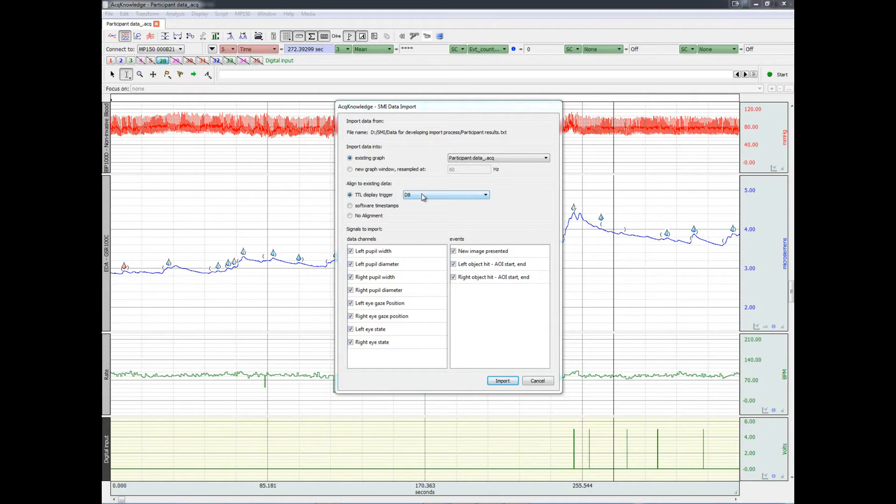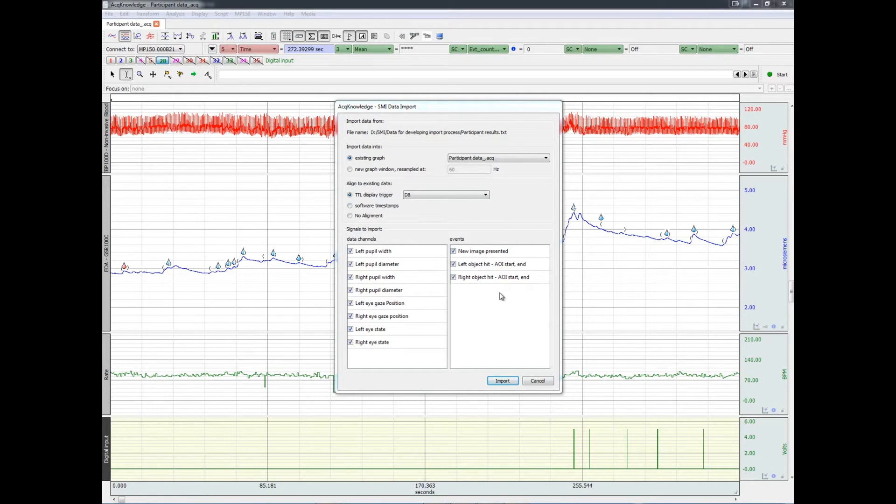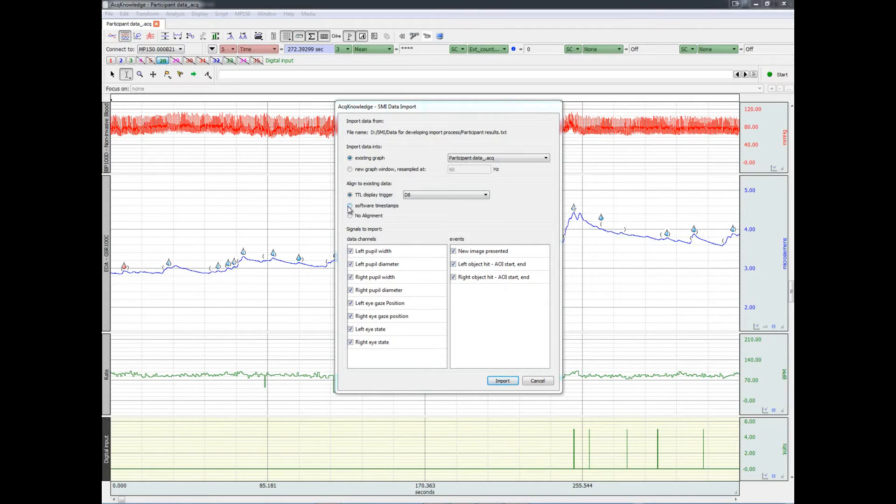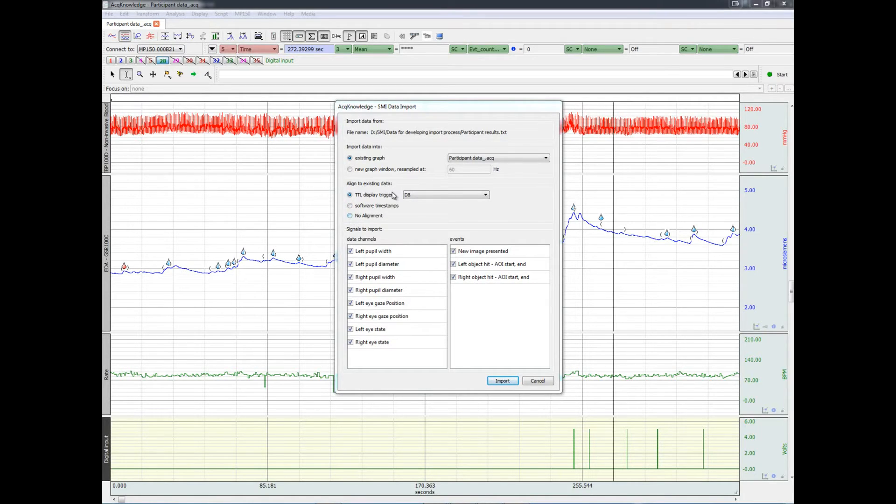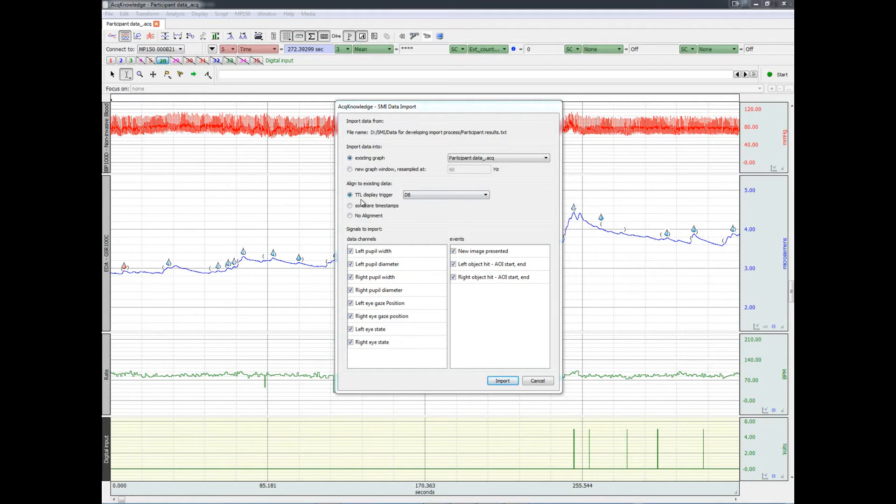We can also choose which signals and event markers to import. Note that we could also use software alignment or no alignment, but the highest accuracy, of course, is achieved via TTL trigger marker. Let's import the data.